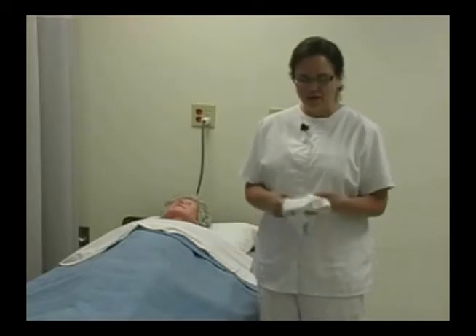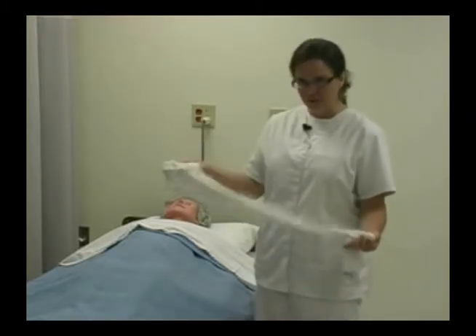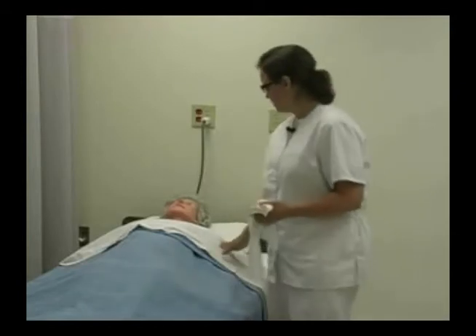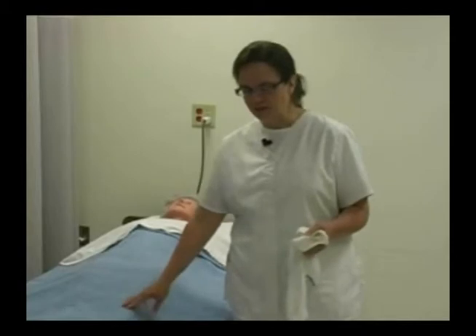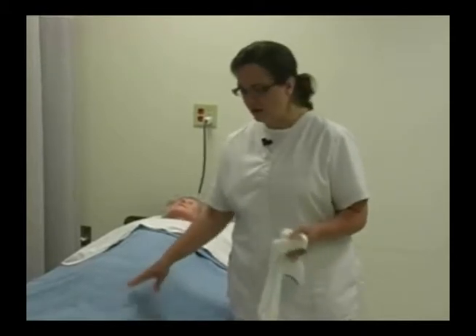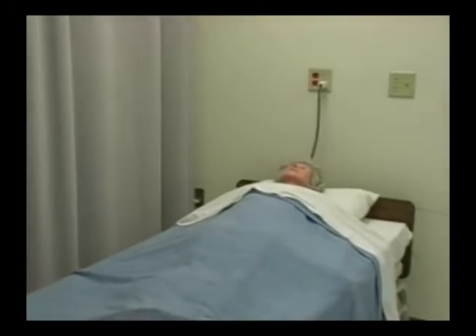I've done my beginning five and obtained the stocking. I'm going to be putting on support stockings for my patient. Hello, Mr. Gray. I always put support stockings on with the patient's legs elevated. He's in his bed, so I'm going to raise the bed to a comfortable working height.